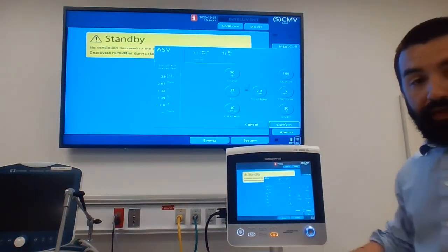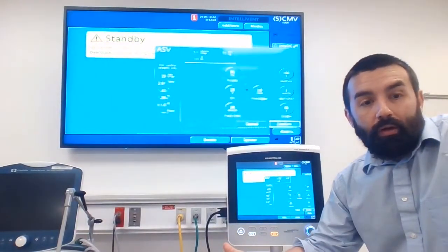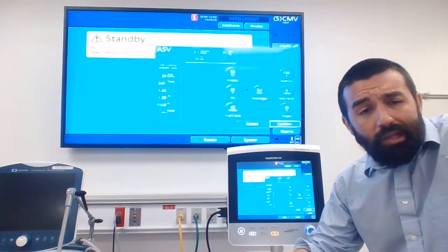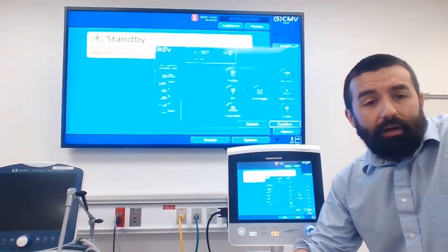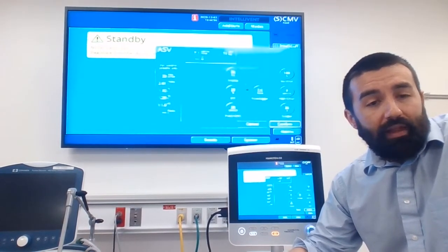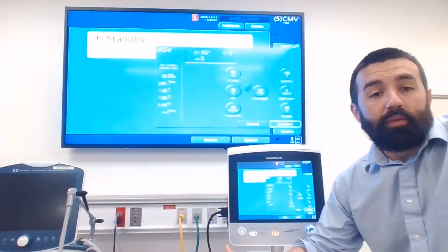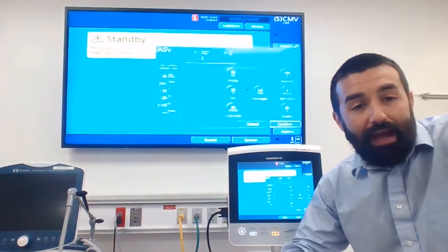When you look at the things that pop up, think about usually coming up with ventilator settings for a regular patient in a traditional form of ventilation: you're having to think about respiratory rate, about tidal volume, and you're trying to come up with an appropriate minute ventilation for that patient. You're having to set a flow rate or an I time to make sure you have an appropriate time for exhalation, an I time conducive with effective gas exchange.